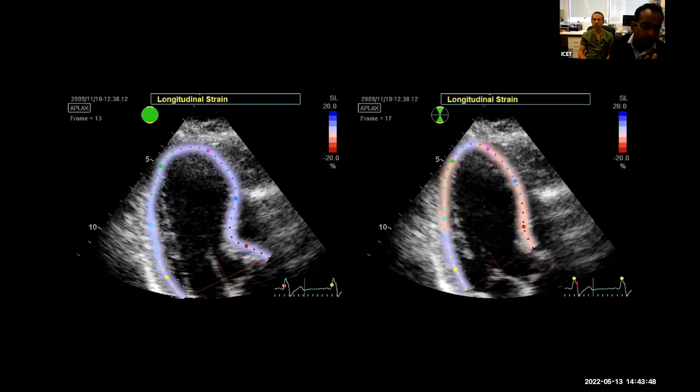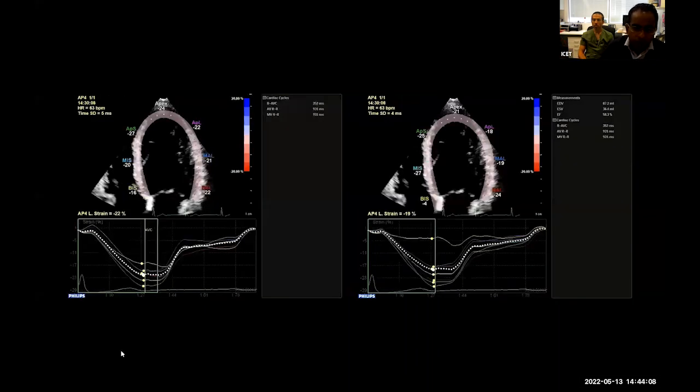The only way you can improve this is by doing more and more strain. They've come up with a magic number of about 50 strain measurements before you become more consistent with someone of an expert level.